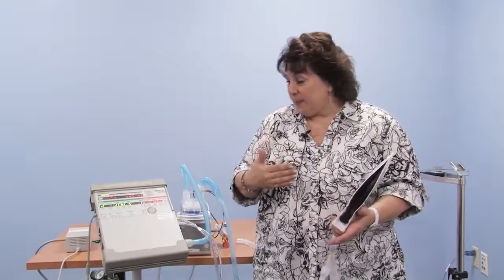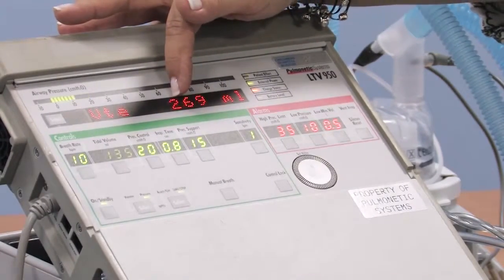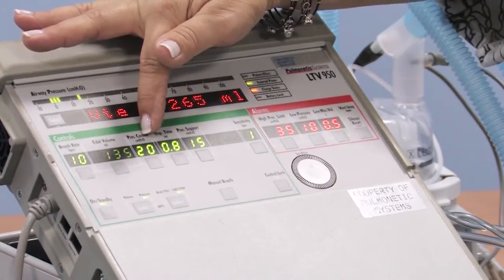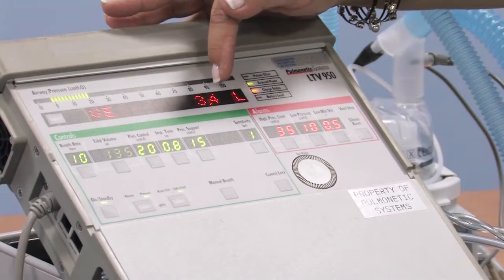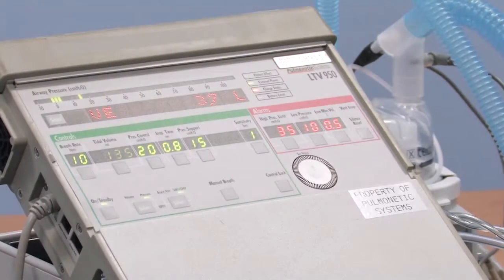So in a minute, how much air did my child use on the ventilator? Well, if my child's breath is 300 cc's large and they breathe 10 times a minute, then that's 3,000 cc's of air. So it's just math. Right now, we would say that this breath is going between 150 and 250, because we have 2 different size breaths here. We have the mandatory breath, which is more pressure and larger. The machine is multiplying the breath rate and the size of the air and coming up with 3.4 liters of air in a minute that it's seeing your child exhale.